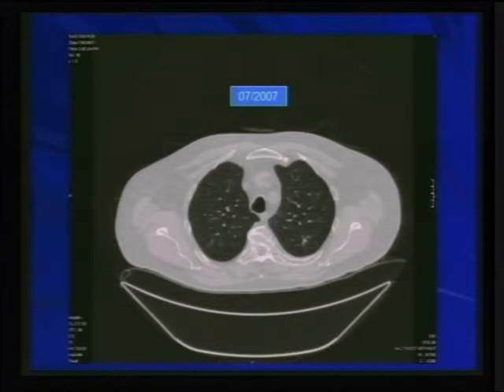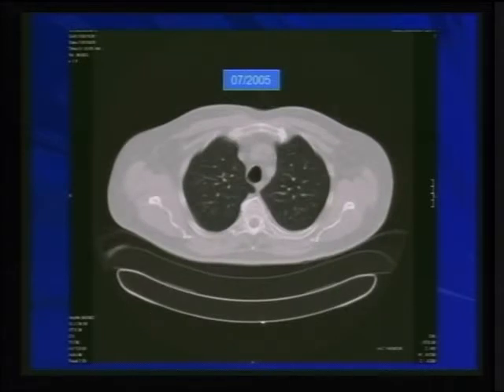But one thing that is important as far as pattern recognition, when the lesion is very small, is you have to do some follow-up. So try to get the prior studies, whether it's chest X-ray or a CAT scan, because that's how you can see that the lesion is evolving or is stable. And that's how you can determine if the lesion has a potential malignant nature or benign nature.